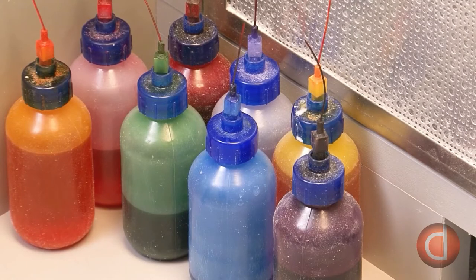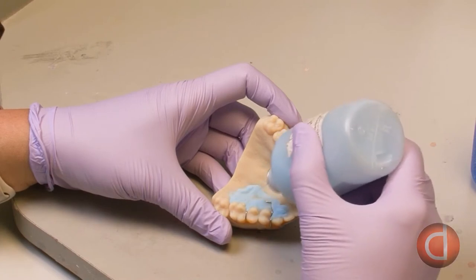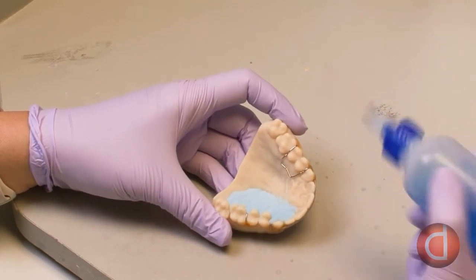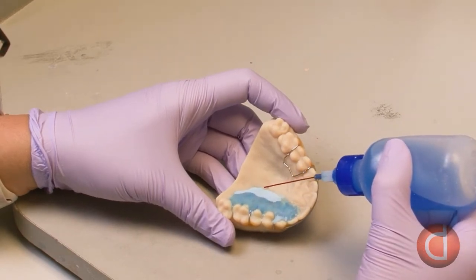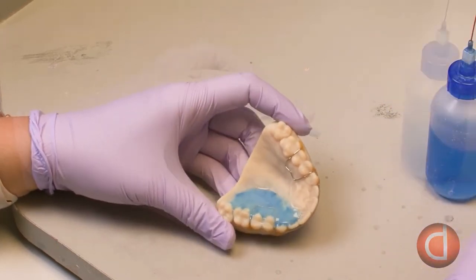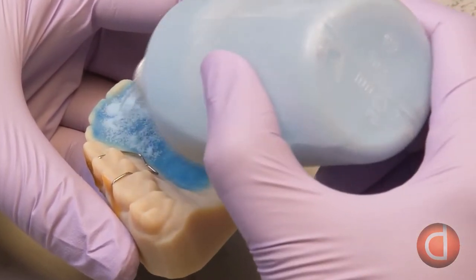Orthodontic acrylics come in all sorts of colors. The acrylic consists of a powdered polymer and liquid monomer that react when mixed and will harden in about 20 minutes. The technician first puts down a layer of polymer and makes sure it flows underneath the wire framework, then takes the liquid monomer and adds it to the polymer. She continues to pour about three layers of material all around the palate until she has built up an overall thickness of about three millimeters.